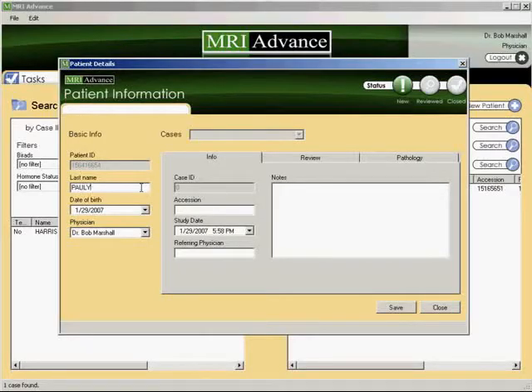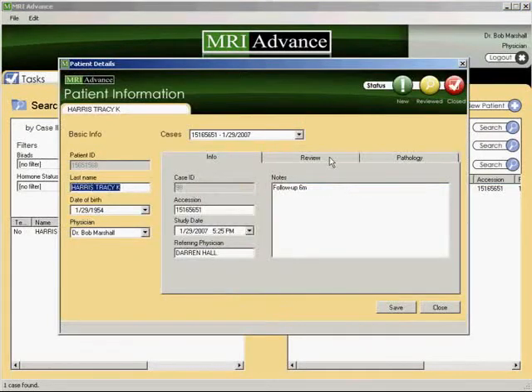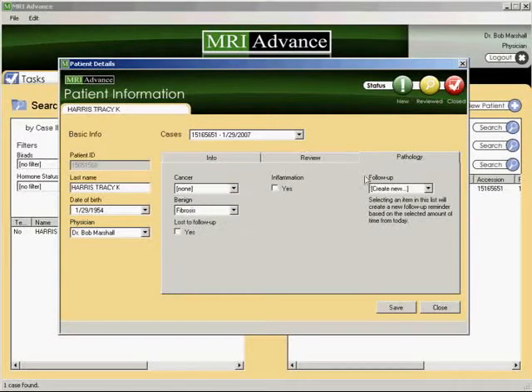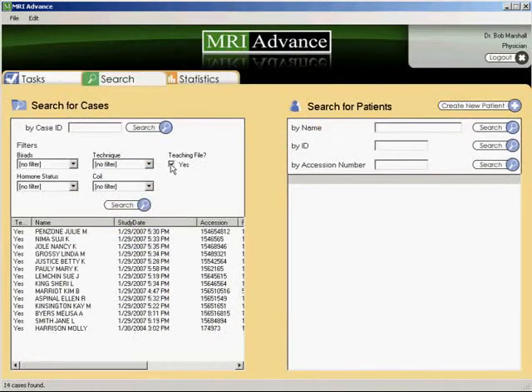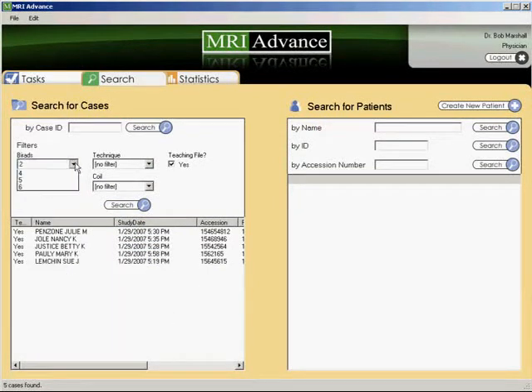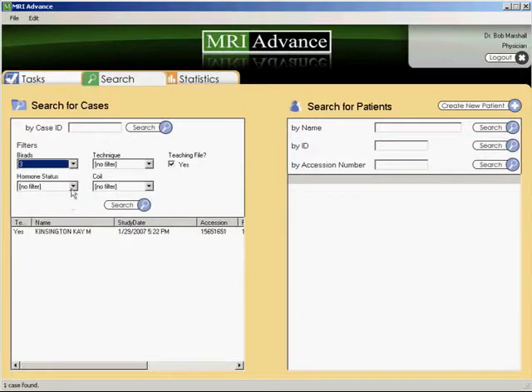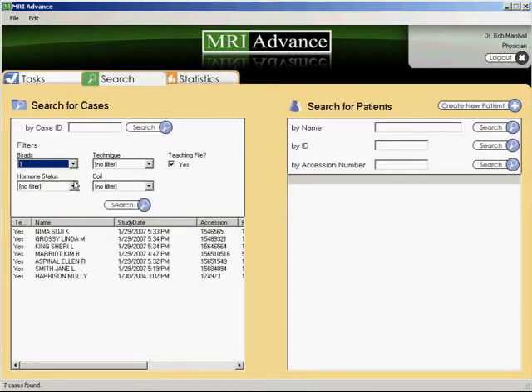A case diagnosed as a BI-RADS 4, 5, or 6 will be flagged to follow up on pathology results in one month. The pathology results are then entered to verify or complete all of these BI-RADS cases. Specific comments can be entered for each individual case. Each pull-down menu also has an other category, allowing tailoring to your specific practice needs. The software allows you to search for patients by pathology, reporting the total number of cases with that pathologic diagnosis and noting which ones are designated for teaching or lecture purposes, as well as whether the case is pathologically verified or currently designated as an unverified teaching file case.